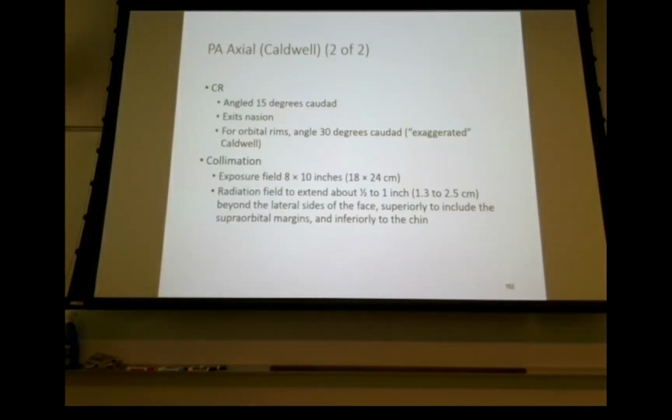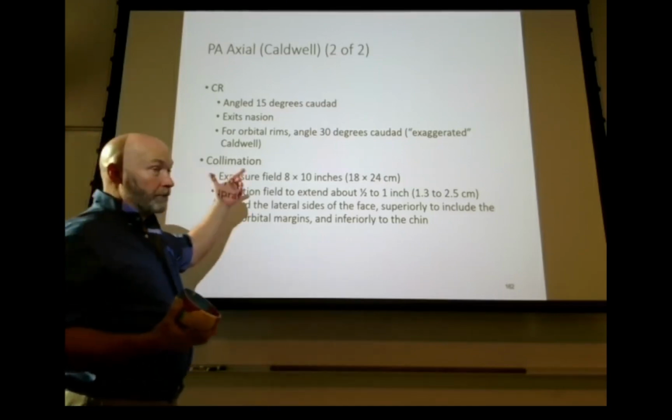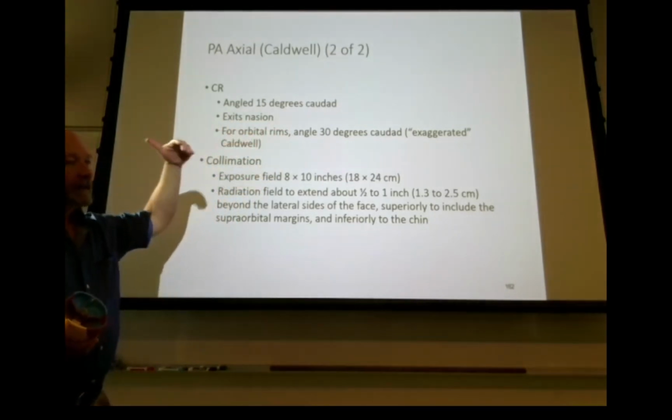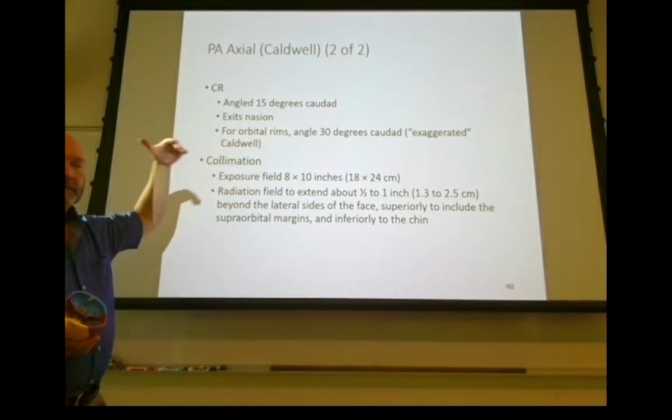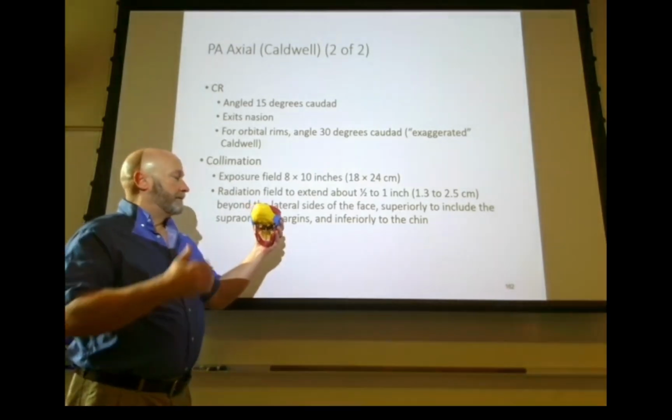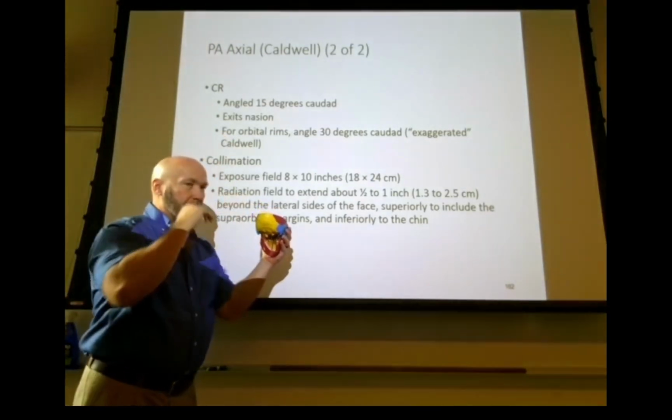All right. So Caldwell. Going to be the exact same Caldwell that we looked at before. Remember that the Caldwell only incorporates that 15-degree angulation. Can be done AP or PA. If it's PA, which is preferred, then we're going to use a 15-degree caudal angulation.